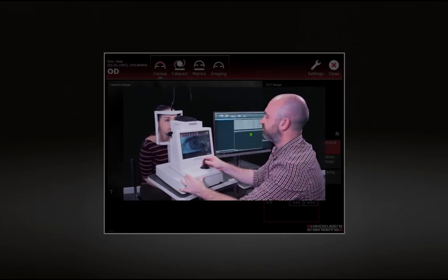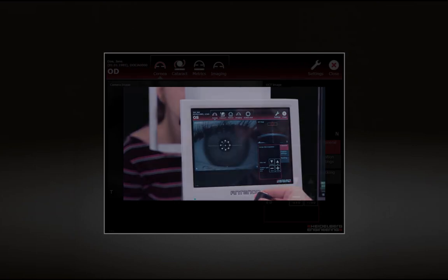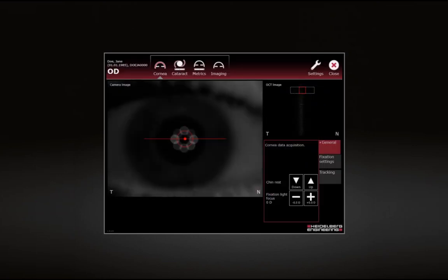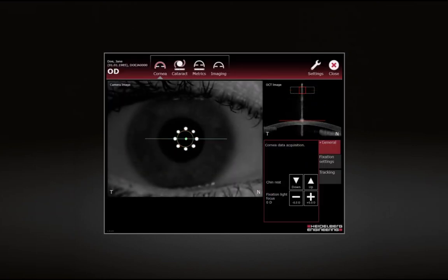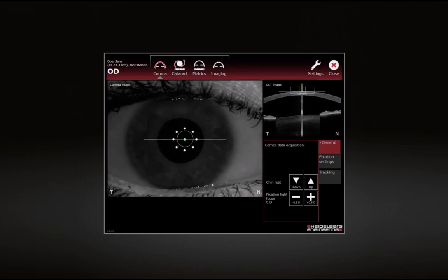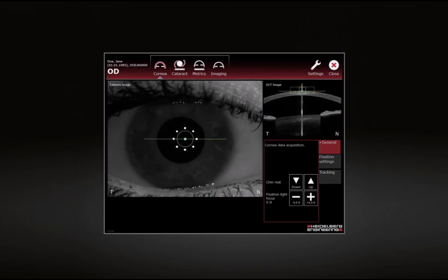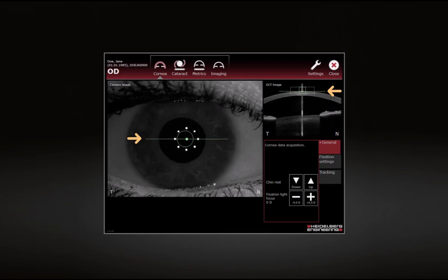Use the joystick to align the camera laterally. Carefully move the camera towards the patient's eye. Align the camera so that the cornea and the corneal reflex are within the dashed box.